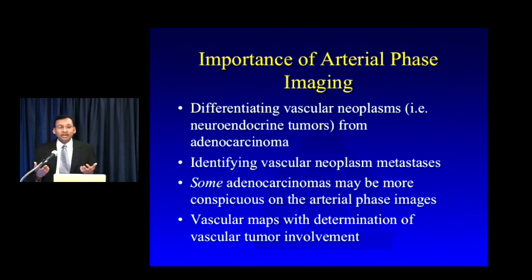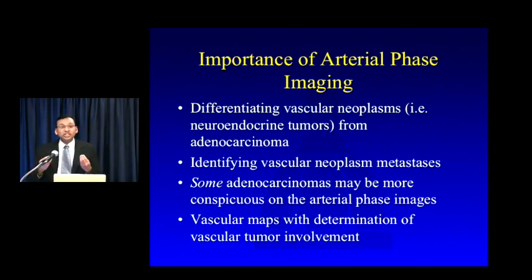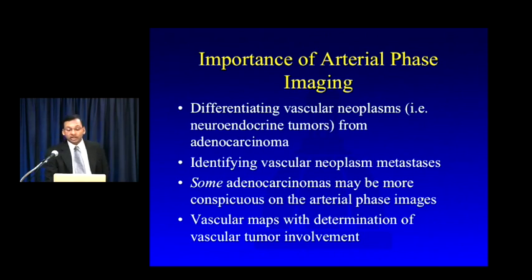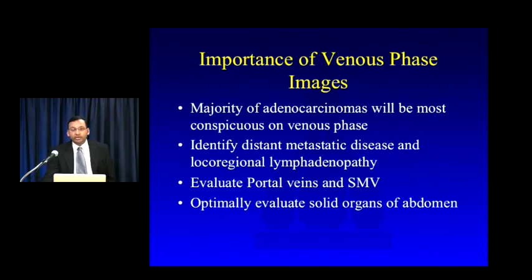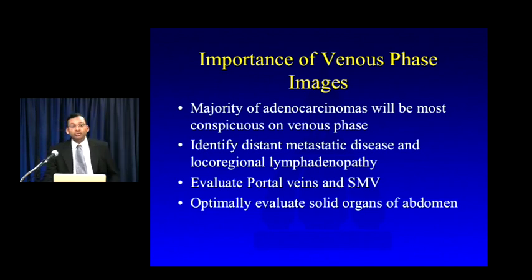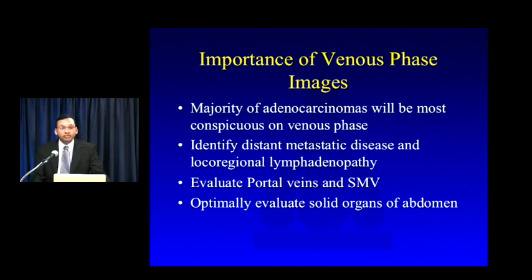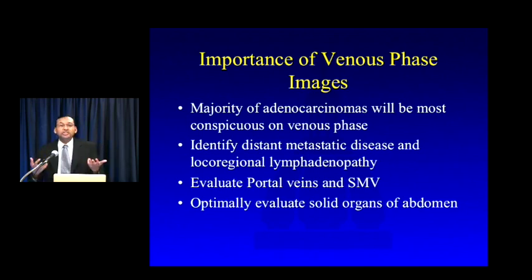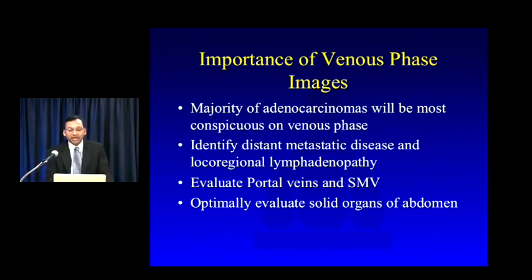Even once a lesion is identified, vascular mapping helps determine vascular tumor involvement — critical for adenocarcinoma. The distinction between subtle abutment versus full 360-degree encasement of the SMA is quite significant for resectability. The venous phase is most important for adenocarcinoma: the vast majority are most conspicuous then, and identifying metastatic disease — especially hepatic and local regional lymphadenopathy — and assessing portal vein and SMV involvement for resectability is best done on venous phase images. You must also evaluate all solid organs, best done on the venous phase.